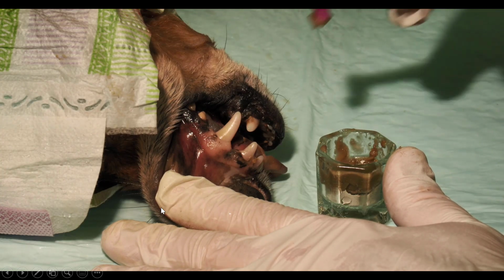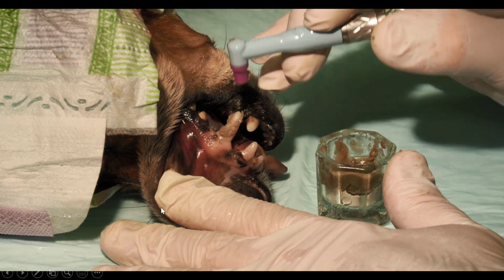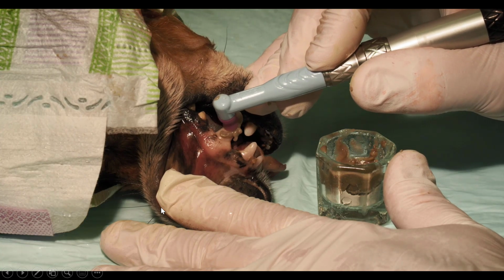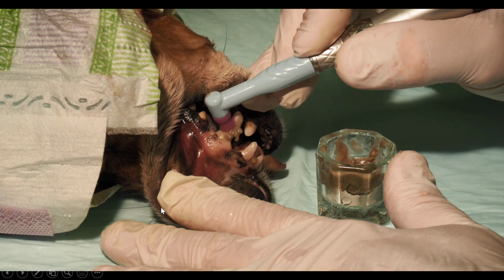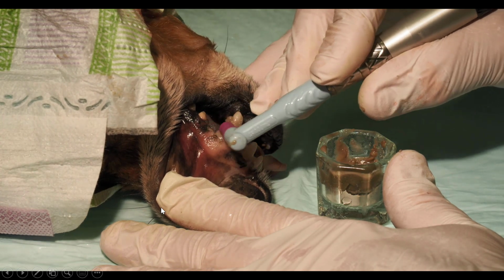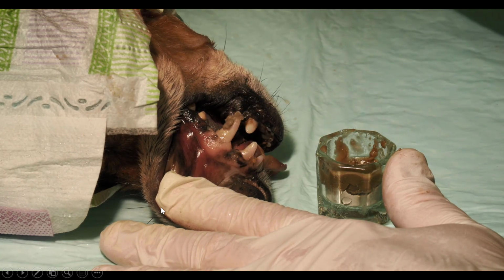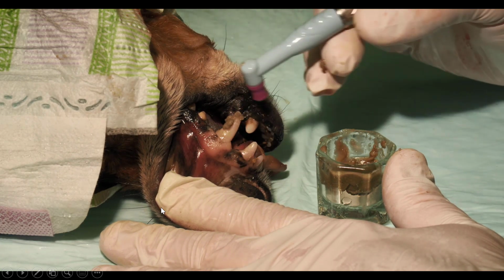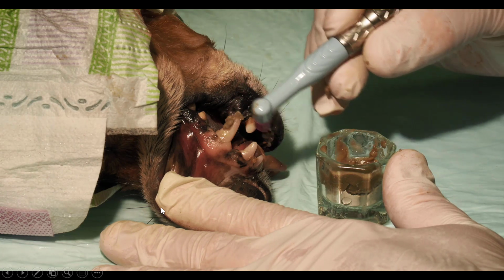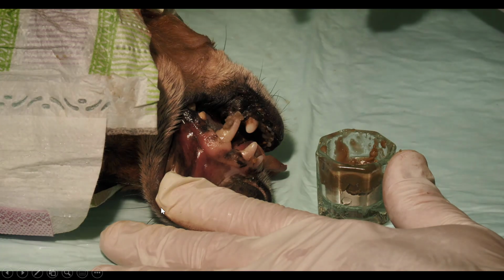So always get plenty of polish, and I'll usually kind of smear the tooth with it to start. And then start your prophy angle, put some pressure down. You should flare out the edges like that a little bit, and always put some pressure down to flare up underneath the gum a little bit. And that way you're going to clean the subgingival area as well. And again, cover every square millimeter of every tooth surface, remembering the green plaque. And then after you polish the entire arcade, you can flip them over and do the other side.